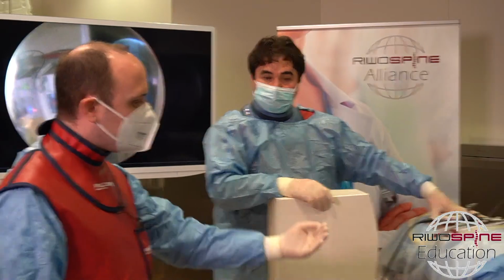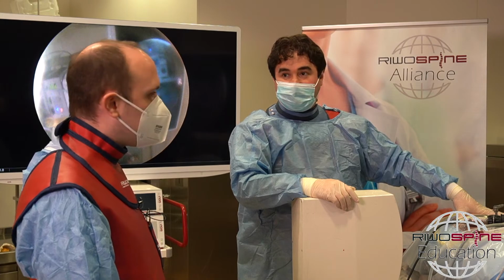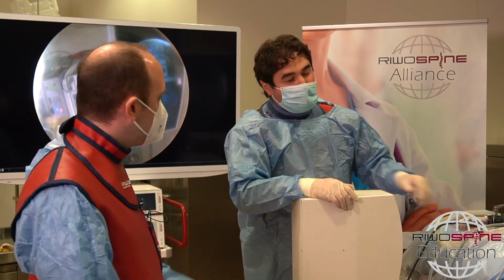And I assume that for the regular approach, we work on the ipsilateral side of the herniation, so we're not going to the contralateral side in a regular case. Yes. Is there any indication when you would go?